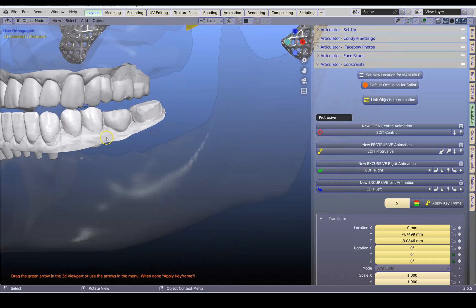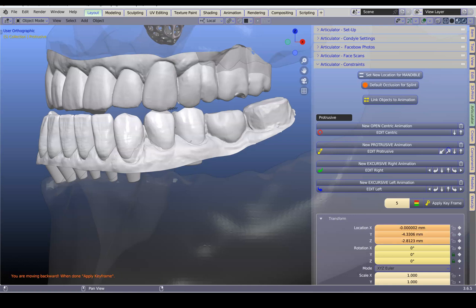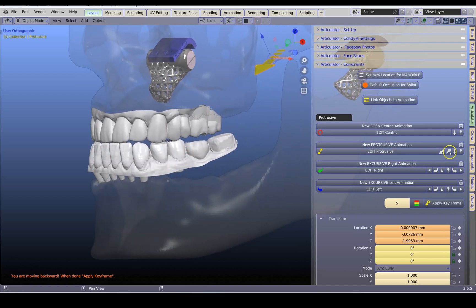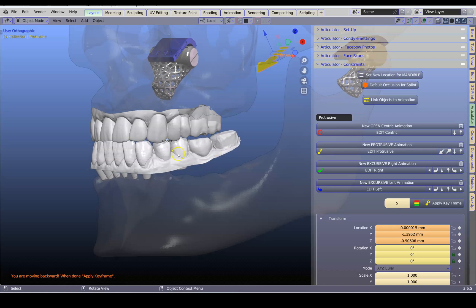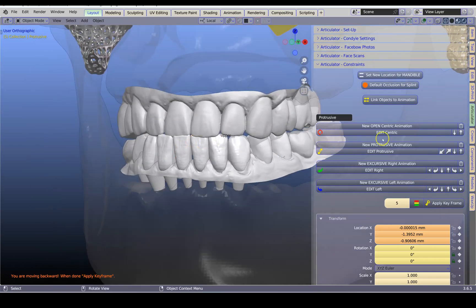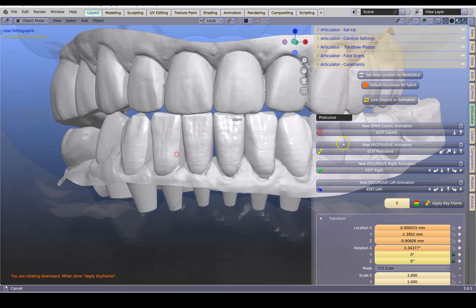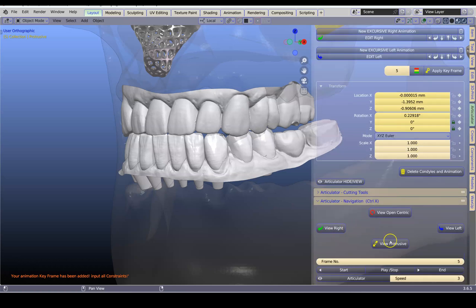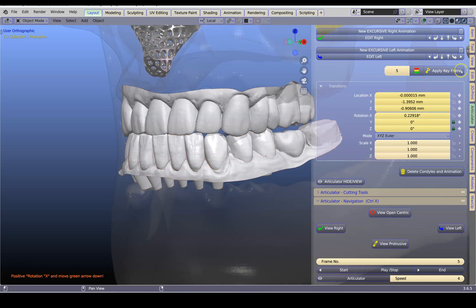I'm going to have a look at it from the side because it's quite important to do that. These keys allow you to retrude it and you'll see how these condyles are going to move back at the same time. Basically my aim here is to get them to intersect and then I'm going to open it up slightly as well using the down arrow key. So here we've got a little bit of an intersection happening. Then simply click on Apply Keyframe. When we view the protrusive we should be able to see the protrusive movement.